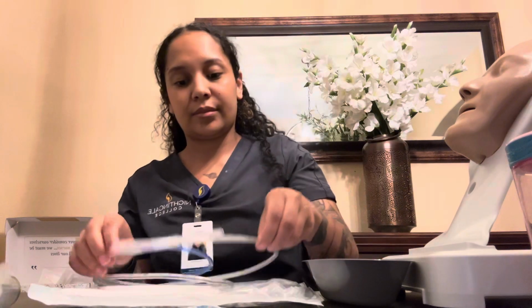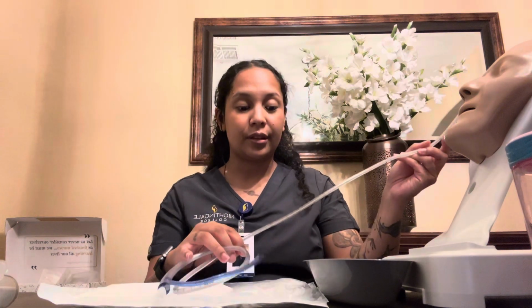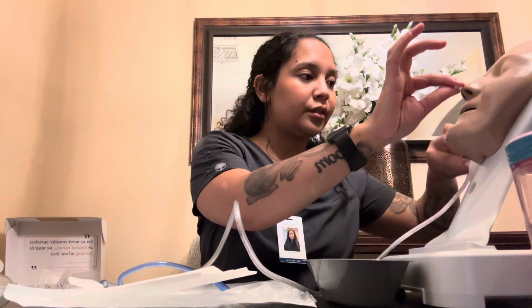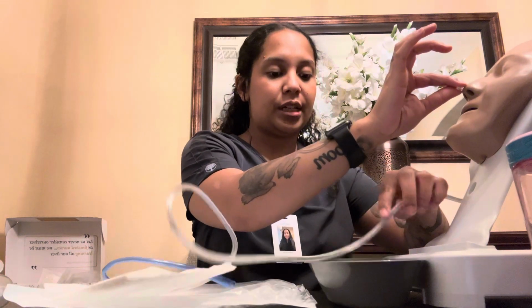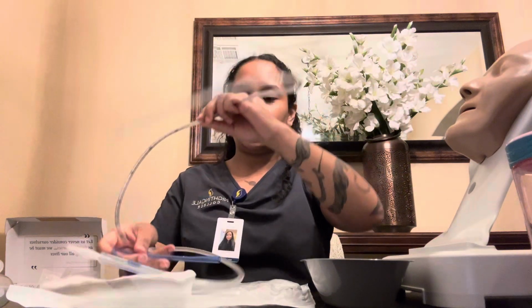Okay, now let's continue. Our water's already warm. We got this set up. Cool. So before, I'm going to measure her first. So we're going to go from the nose to her ear to the xiphoid process, okay? And the mannequin is really short, but let's say it's 50. We'll say 50 on a real human. Okay, so I would go here, go to the ear, and then again, we said it's 50. Okay, perfect. Let's go ahead and start.